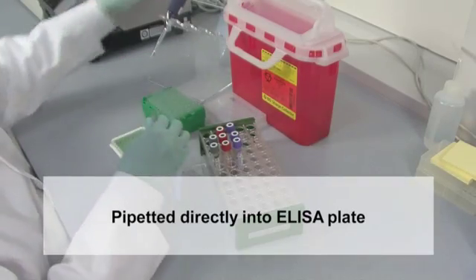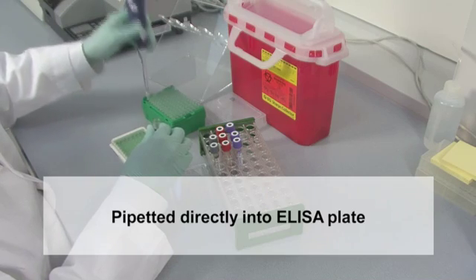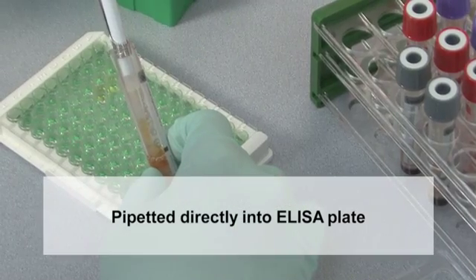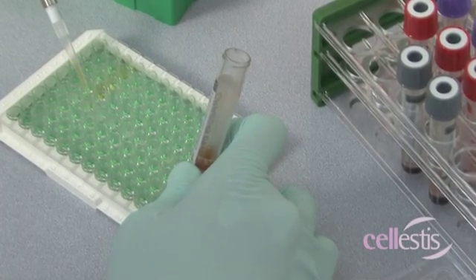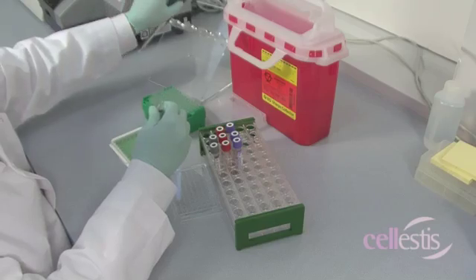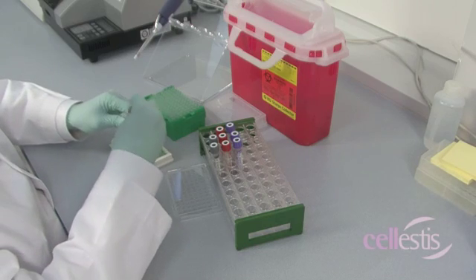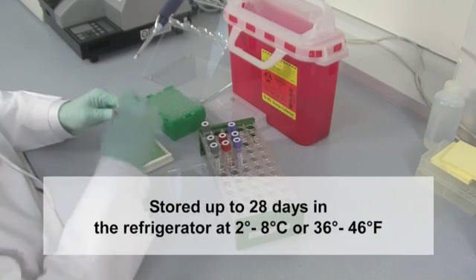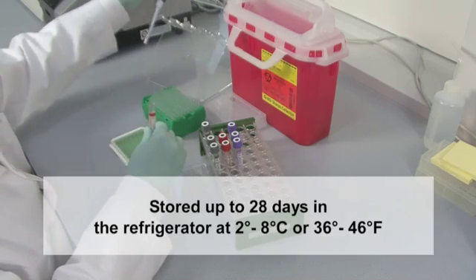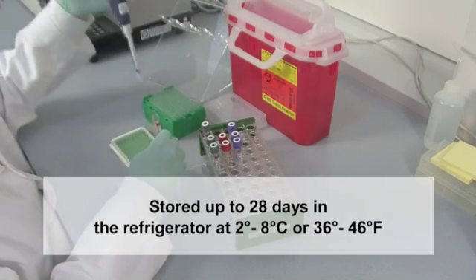After centrifugation, plasma samples can be pipetted directly into the 96-well ELISA plate for further analysis. Alternatively, the tubes containing plasma can be stored for up to 28 days in the refrigerator at 2 to 8 degrees Celsius, or 36 to 46 degrees Fahrenheit.